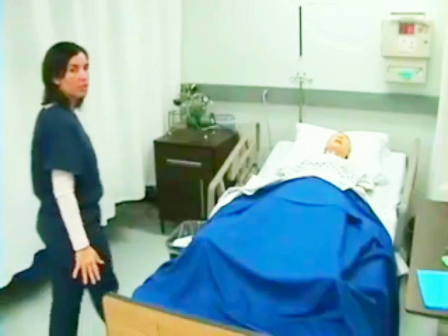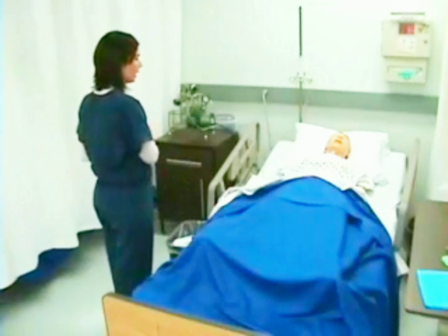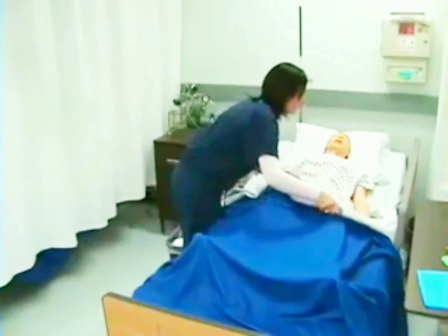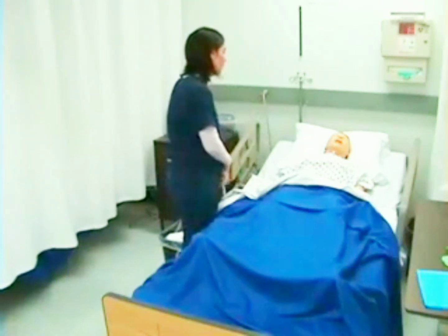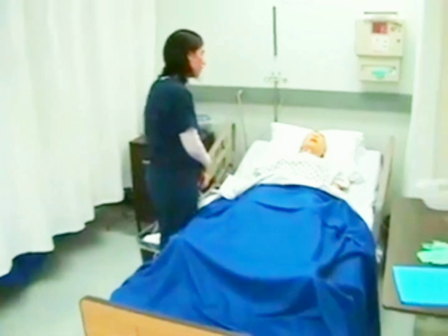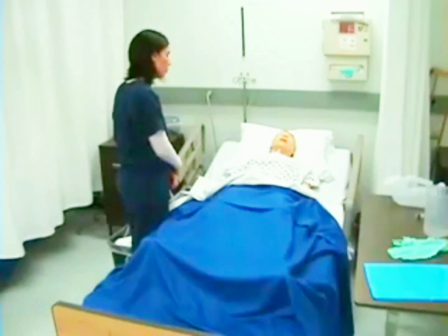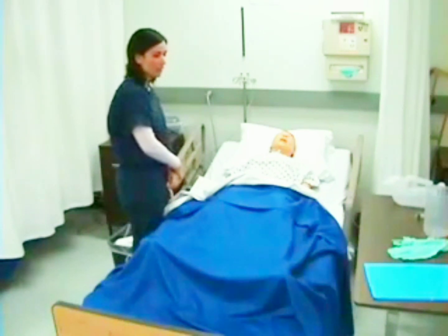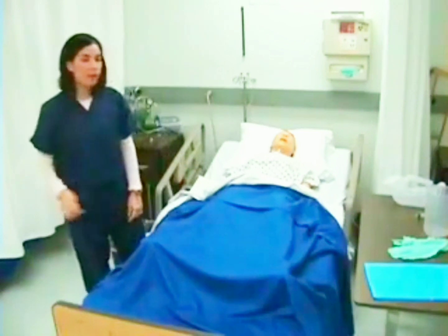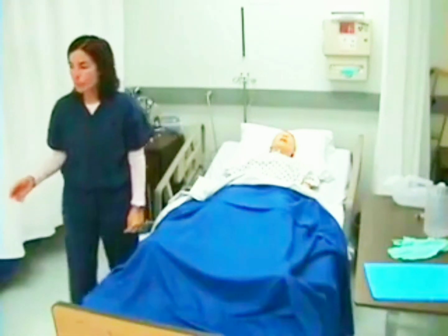I will first enter my patient's room. I'm going to wash my hands and check her identification bracelet, asking her to state her name and date of birth. Mrs. Doolittle, today we're going to go ahead and take your catheter out. You're going to be going home tomorrow and your surgeon would like to see if you can void on your own. You may feel a little bit of pressure when we do that, but we'll get it out very quickly.